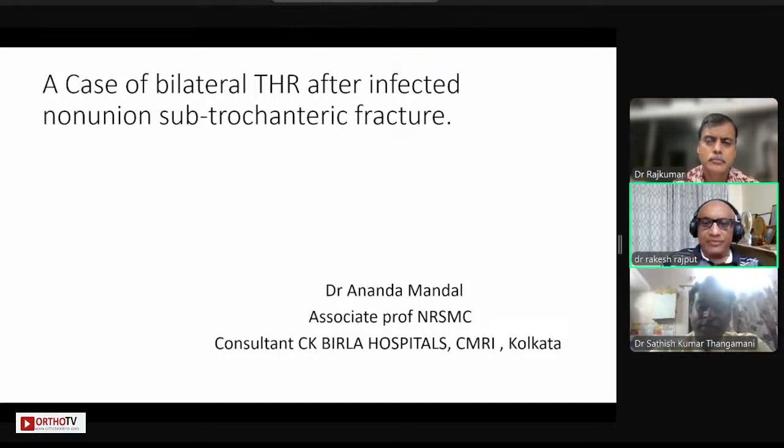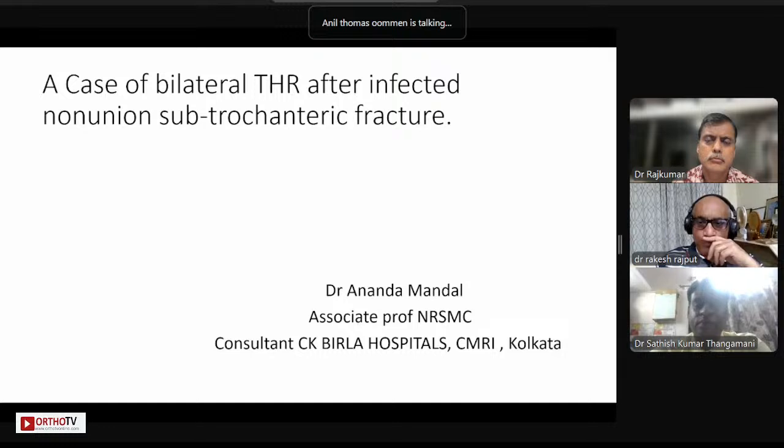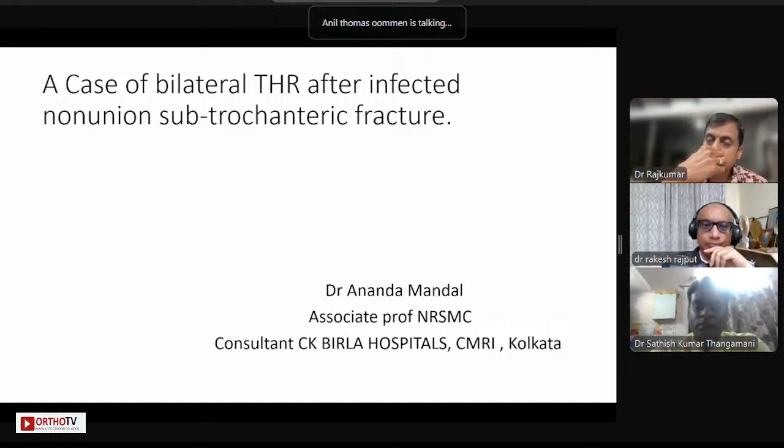No. I've seen some stems from the company which are uncemented also. They also look very thin and slender. Yeah, I'll tell you about that. I know what you're talking about. It is only in select situations where the Wagner 14 starting size doesn't fit that I may have to go down to a 12. I've done one or two so far. They've had some issues with the earlier ones. The company admitted that. The earlier size 12, which tapers down, had an issue. There was a breakage and all, but I believe they've sorted it out. I've done one or two because I had no other options, and it's holding well so far.